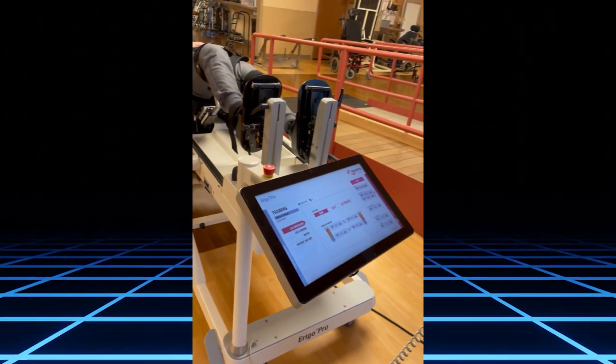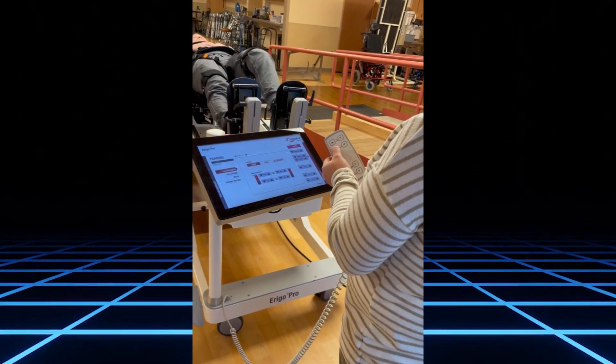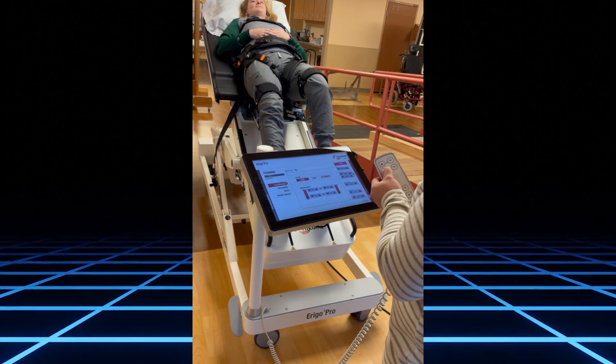Once the patient starts, you can then begin raising into an upright standing position. Depending on the patient's condition, you can go in increments or all at once.